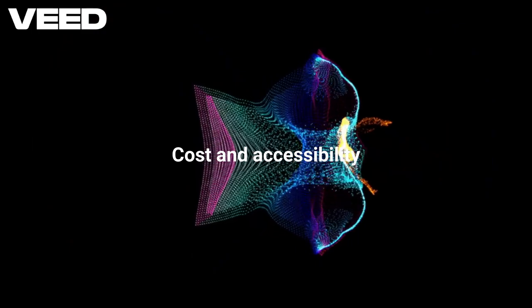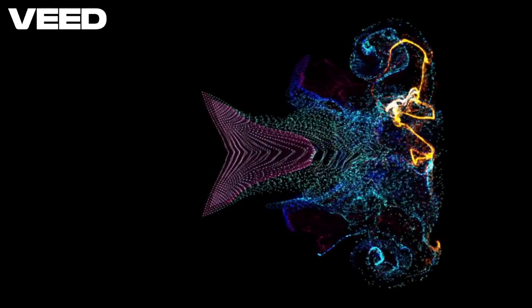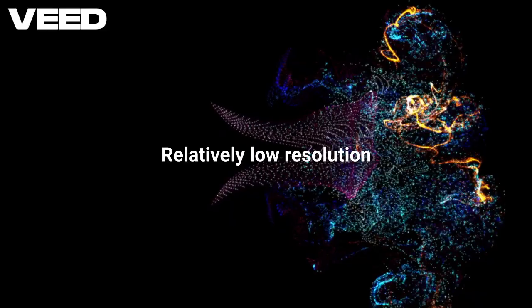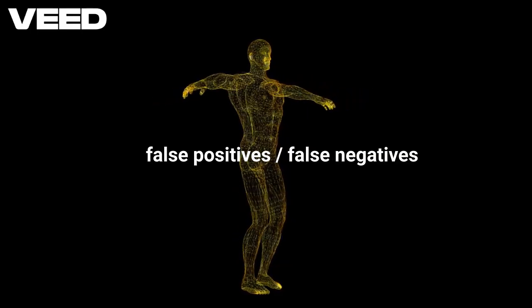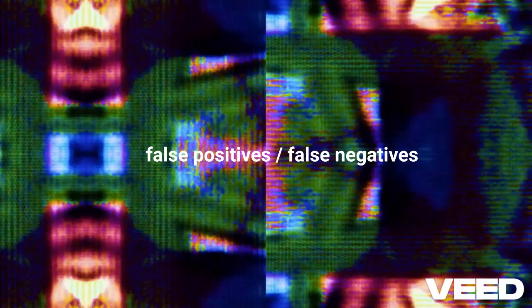PET scans are expensive and not available in every hospital. Lower resolution can miss very small or low-activity tumors. And PET scans can show false positives: infections or inflammation might look like tumors. Some low-grade cancers might not light up at all, causing false negatives.